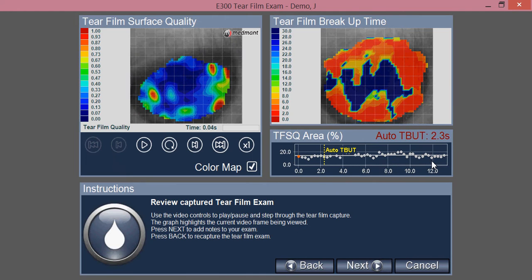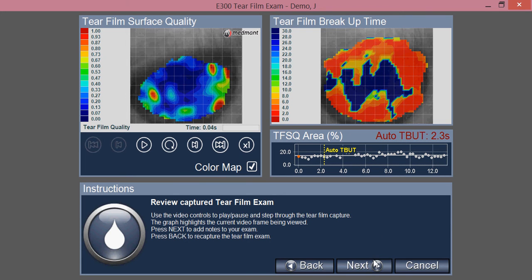If the patient blinks, the capture will automatically stop. Or if you reach the desired amount of time — the 15 seconds — the instrument will complete its capture. When that's done, go to next and finish.